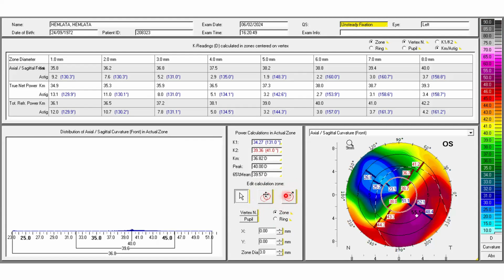Okay. But again, did this not become like a bifocal cornea while you calculated this, as you mentioned in the other cases as well for the keratoconus cases? Did this not become like a bifocal cornea again when you try to shift the center, flat over the pupil and steep over here? Yes, ma'am.